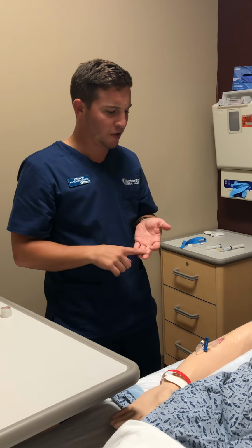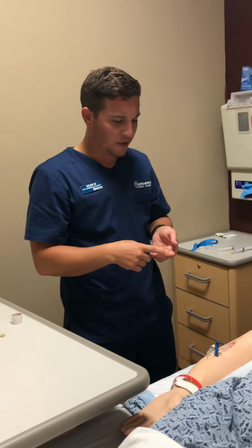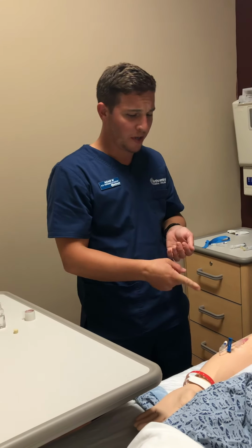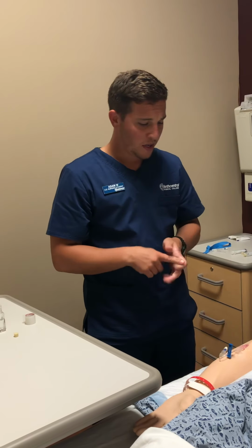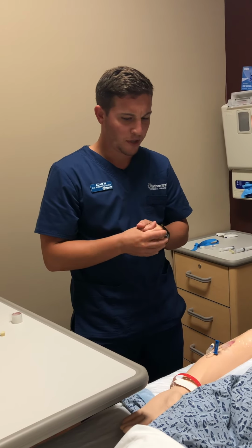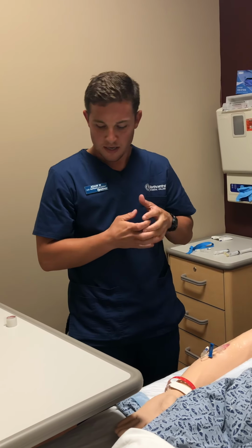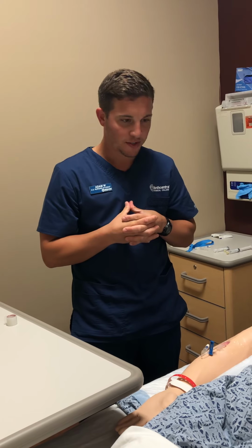obviously my procedure. So how many attempts it took me. I'm gonna put that I used the 20 gauge. We put it inside the left AC. That the patient tolerated it well. We had no complications with it. Obviously, we'll document the right time and when it was done. This concludes my first video of IV insertion.